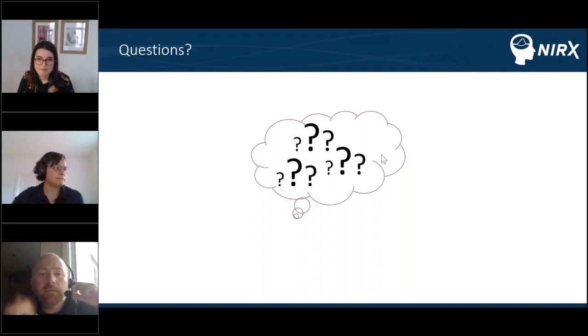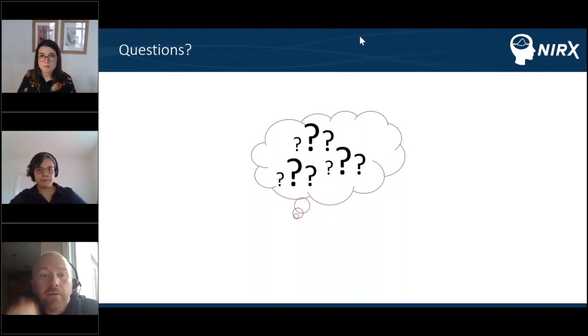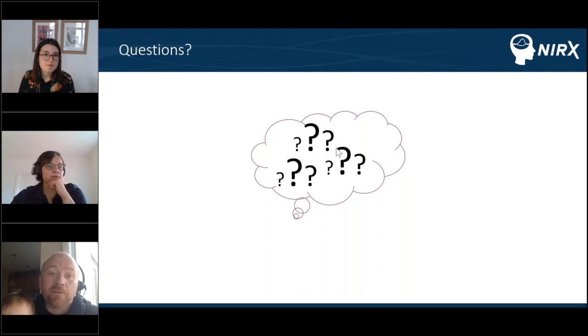So the SNIRF format was something that arose maybe 4 years ago at our NIRS conference. Given all the different formats from all the different companies, we wanted a common format so we could start writing tools. Unfortunately, it took us almost 4 years to decide on what that is. We solicited feedback from people in the society that developed code, and we have just finalized that within the last months.